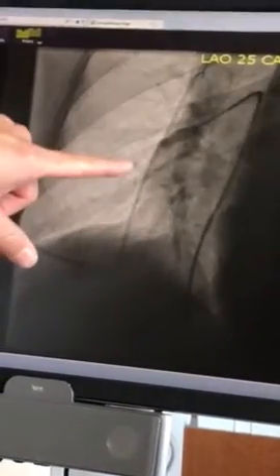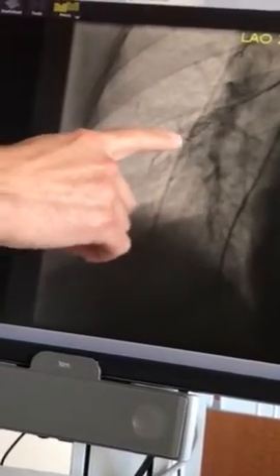So here we are. This is your middle lobe. So these are segments that we hadn't treated before. So we're rotated a little bit. This is more towards the front of you, and this is more towards the back of you. And there's two branches of the middle lobe that we treated. And you see how both of these vessels sort of end, and they should really extend fairly far out. So we're now shifted. We're sort of looking straight at you, and this is the more medial branch of your middle lobe there. So the wire's almost coming straight at us, if you can appreciate that.